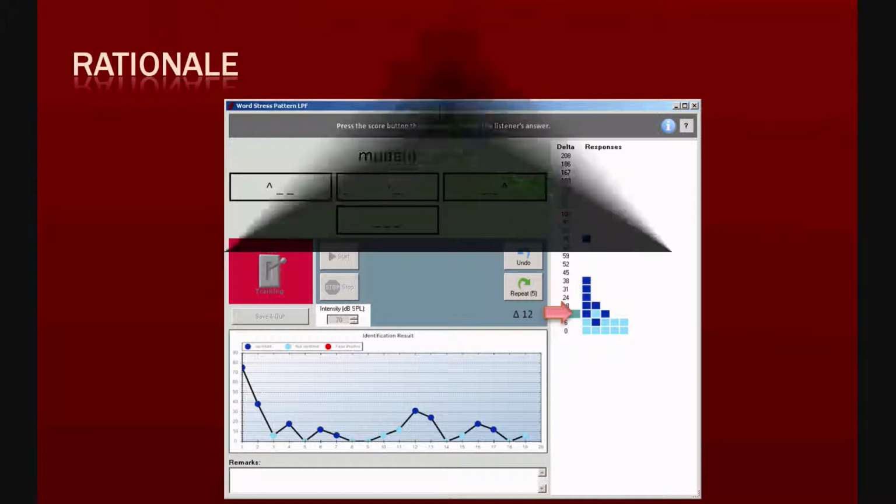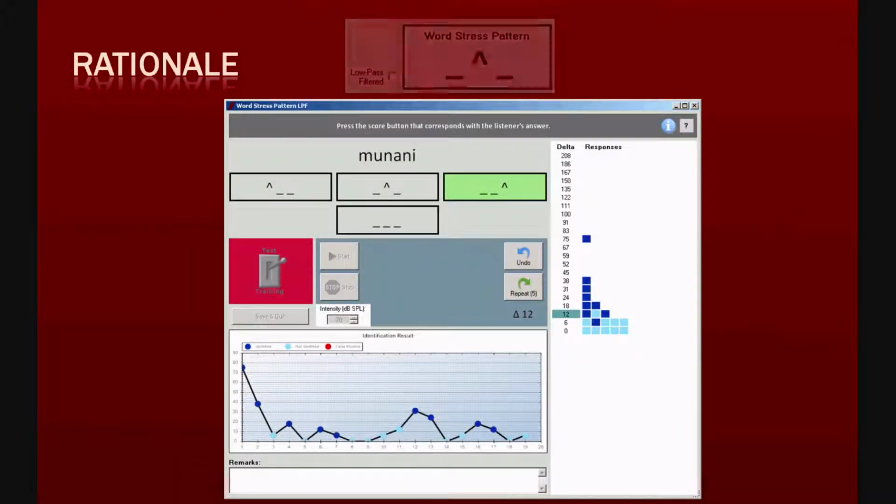Please notice that the cue to discriminate the sounds lies in the difference in fundamental frequency, together with the differences in the harmonics. Since phase locking is believed to be essential for the coding of low frequencies, ACE contains the possibility to low-pass filter the pseudo-words. In this case, all spectral content above 300 Hz is removed from the sound. Now the cue for discrimination is only contained in the low frequencies.